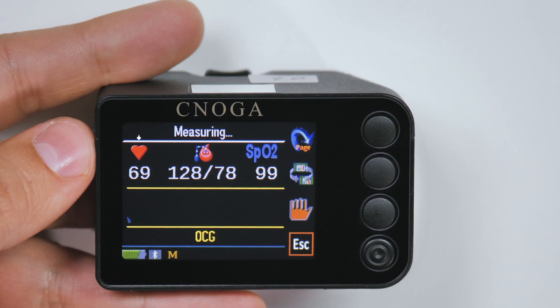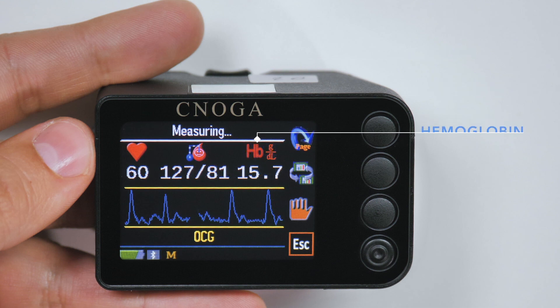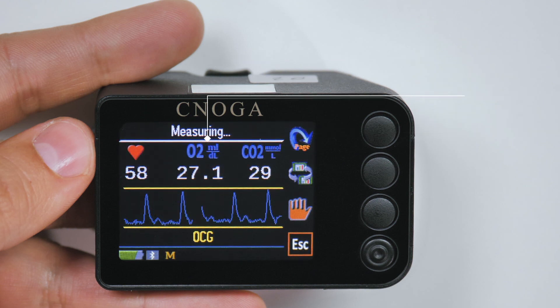With the help of MTX, you can easily measure pulse, blood pressure, oxygen saturation, hemoglobin, pH, oxygen partial pressure, carbon dioxide partial pressure, O2 content, and CO2 content.